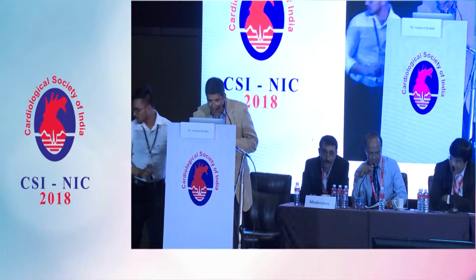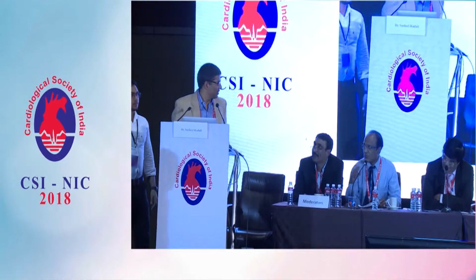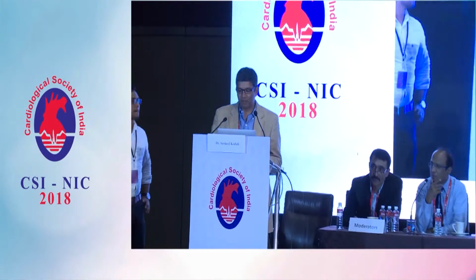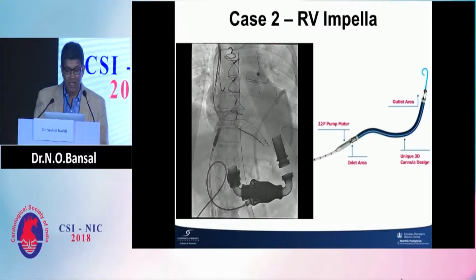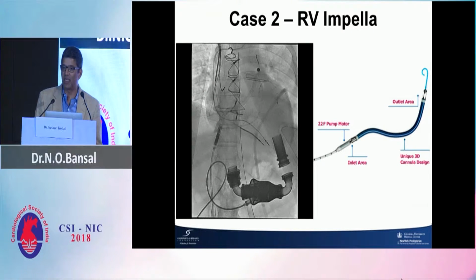Prevention and early detection of complications in structural heart interventional cardiology. I will go through several procedures and some complications. In the end, a lot of this comes down to planning, but sometimes bad things just happen and you get bad luck. This is a case of a patient; we had this introduction to the Impella.